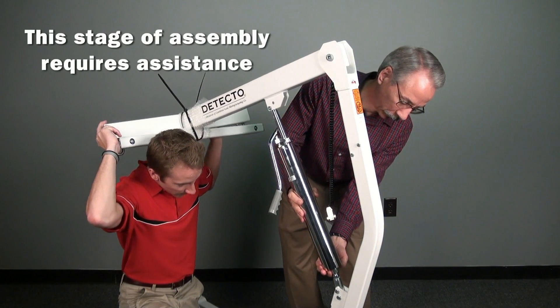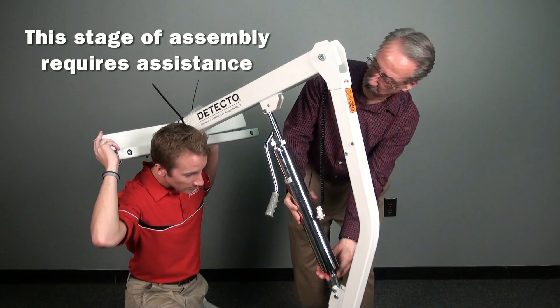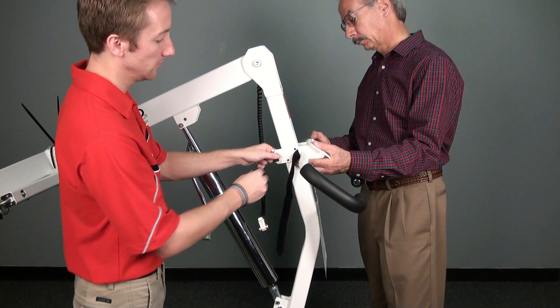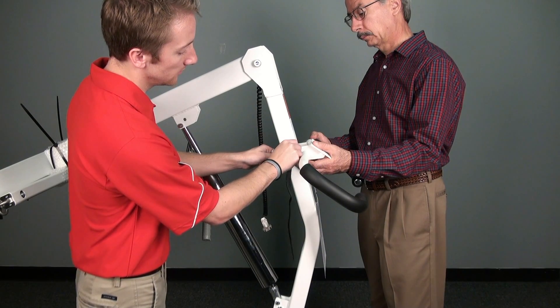Be sure to have the help of someone else as the ball socket is delicate and the boom assembly is heavy. Next, remove the four bolts on either side of the column assembly and attach the push handles, replacing the bolts and securing the handles into place.